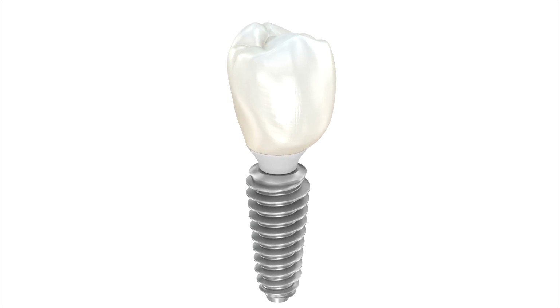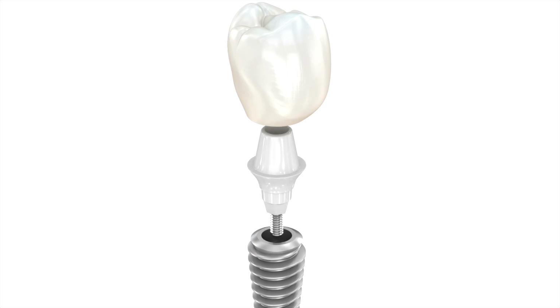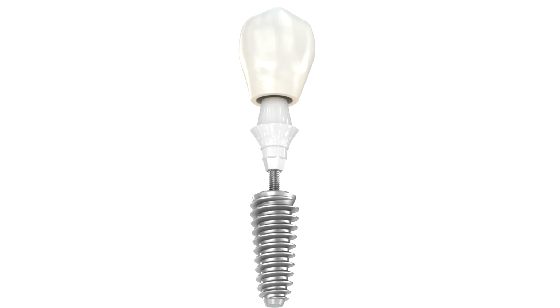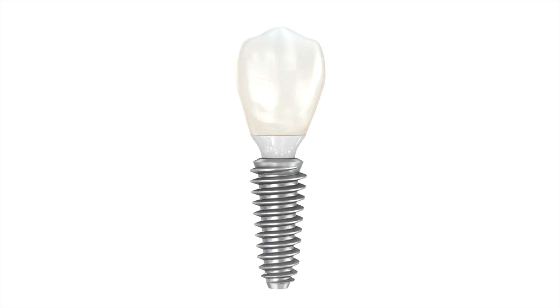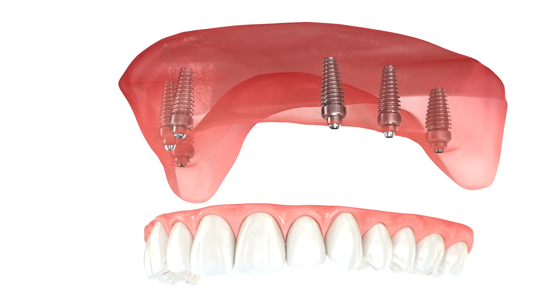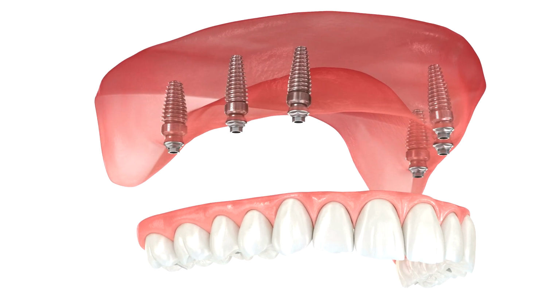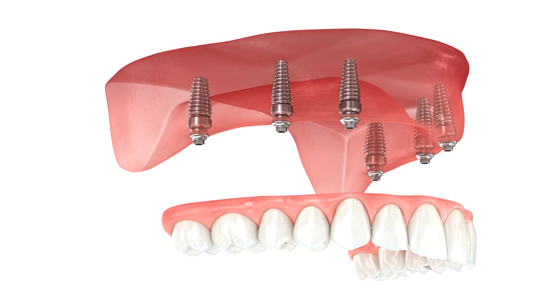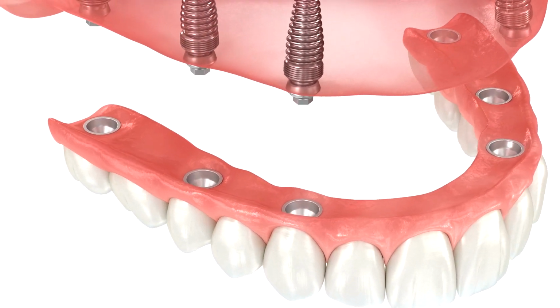1. The material deep dive: titanium grades and beyond. Let's start with materials. The vast majority of implants are made of titanium, but not all titanium is equal. We primarily differentiate between pure titanium, grade 4, and titanium alloy, grade 5, or Ti-6Al-4V. Grade 4 offers excellent biocompatibility, but grade 5, alloyed with aluminum and vanadium, is significantly stronger, up to 40% stronger. This higher strength is crucial for smaller diameter implants or those supporting complex restorations.